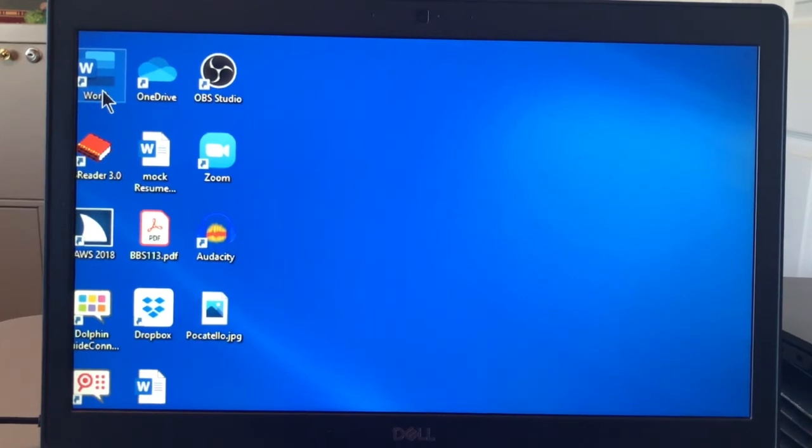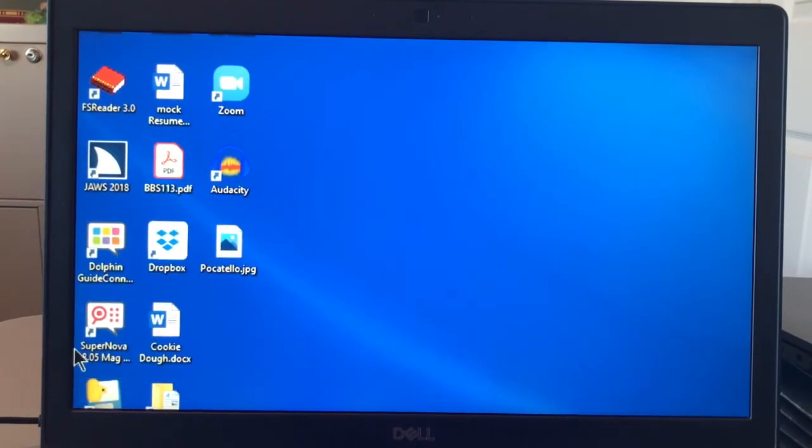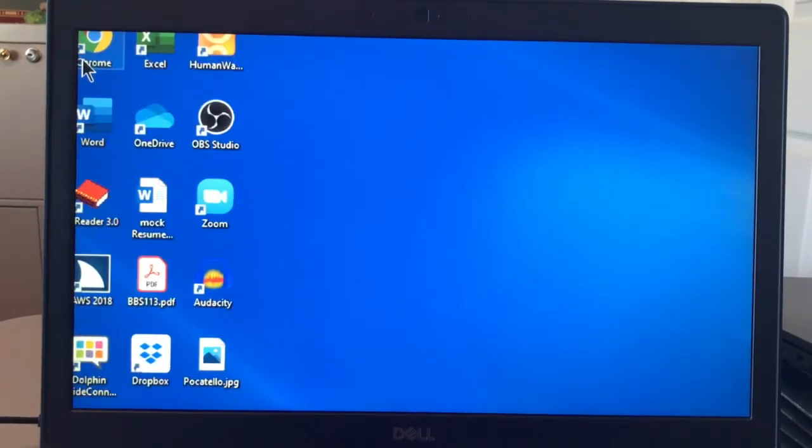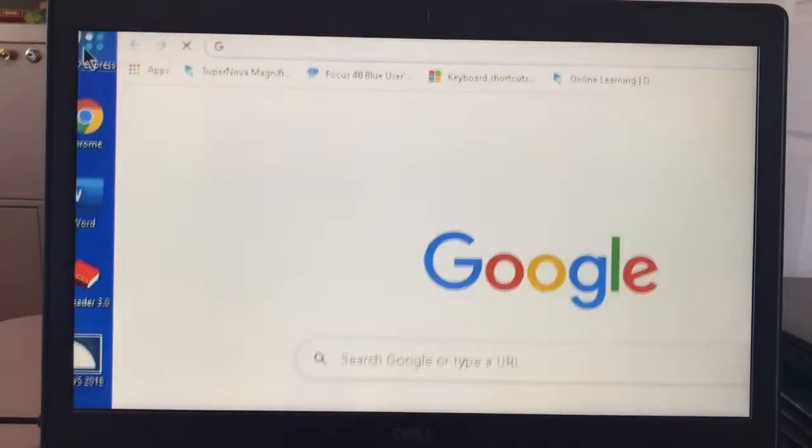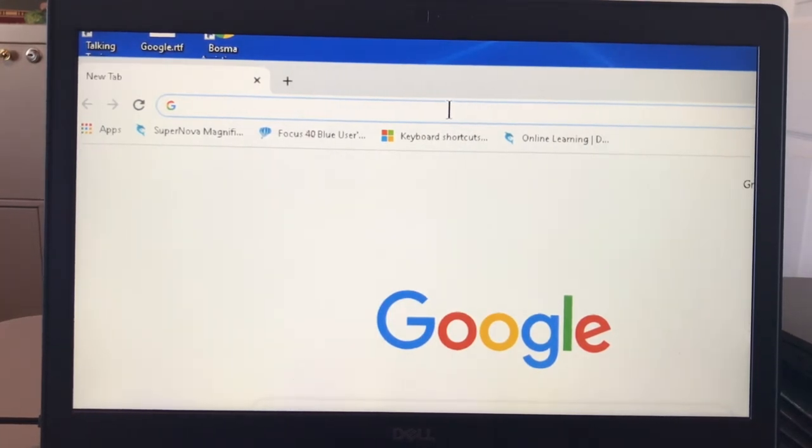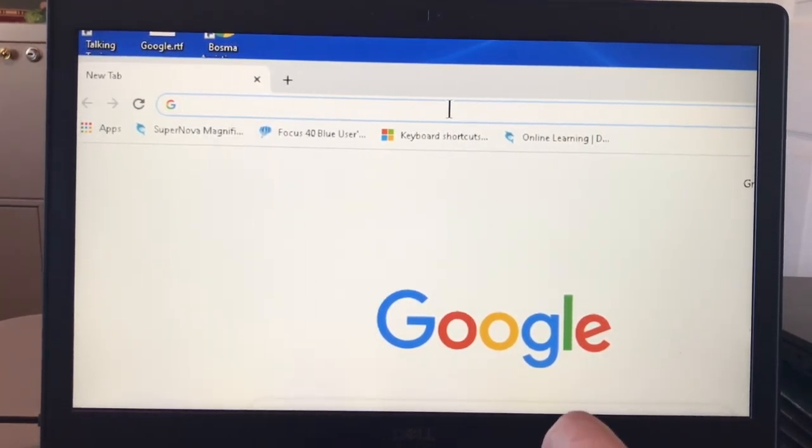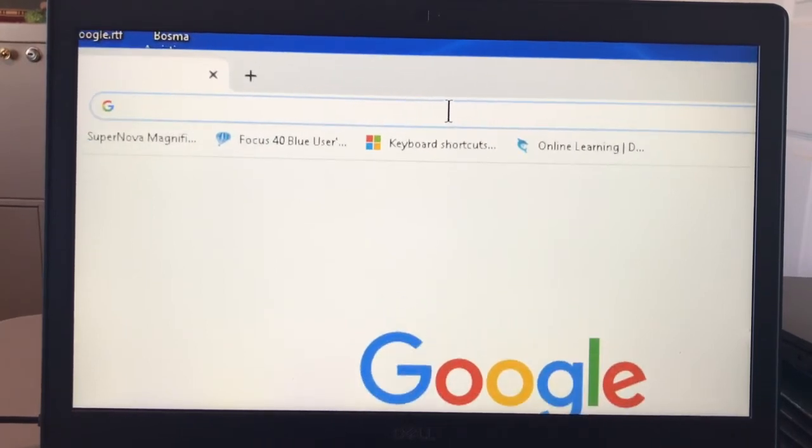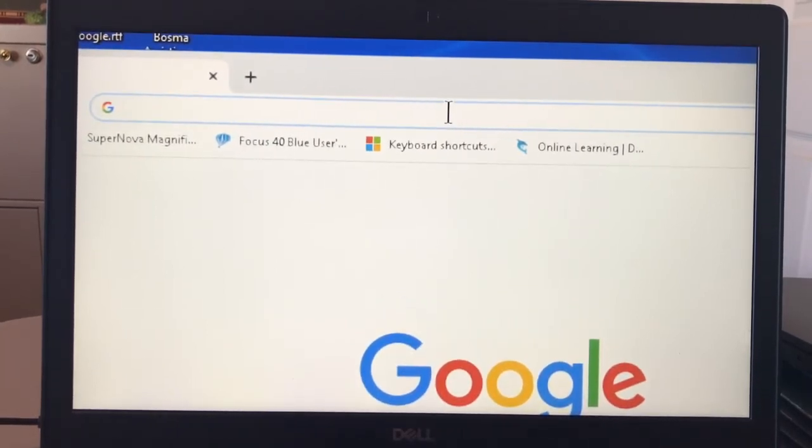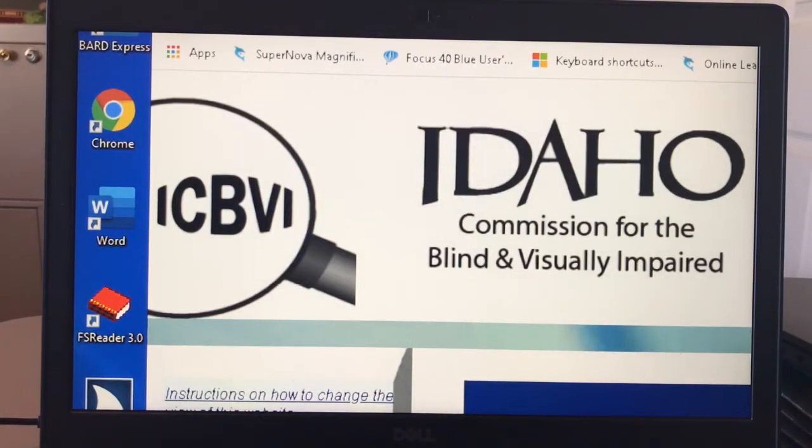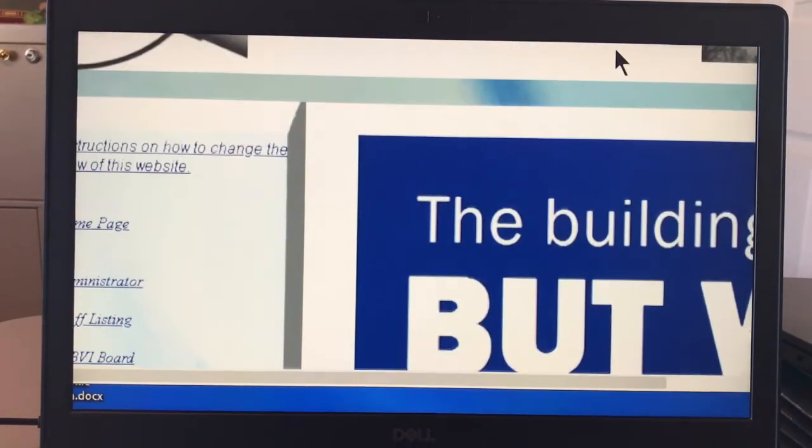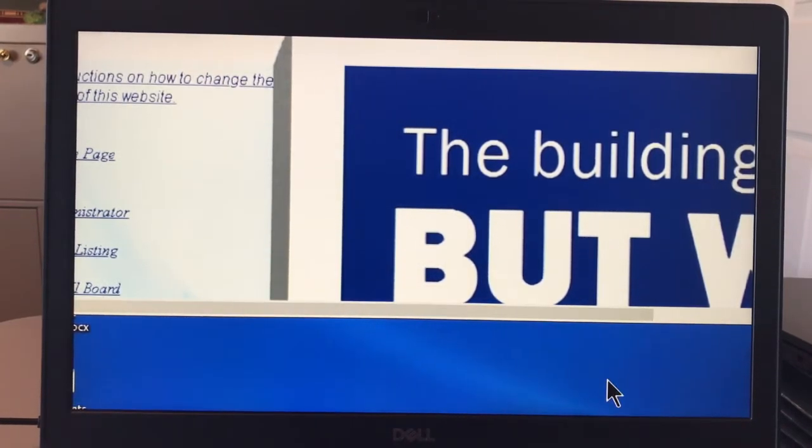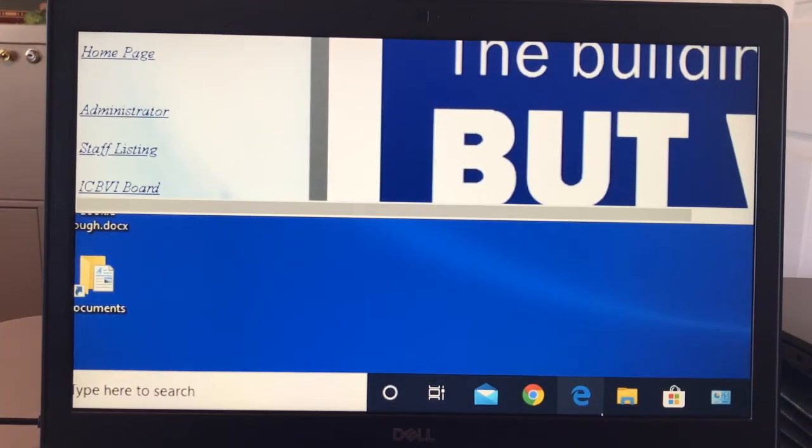A couple of things I want to show you about using the magnifier on the web. I open my Chrome here. You can tell that everything is larger at the top. I can increase with the Windows key and the quick press on the plus. And that increased it. I'm going to go to a website. This is the Idaho Commission for the Blind website. Now as I move my mouse pointer down, I'm going to come out of my browser window, and I'm back on my desktop, and there's my taskbar.